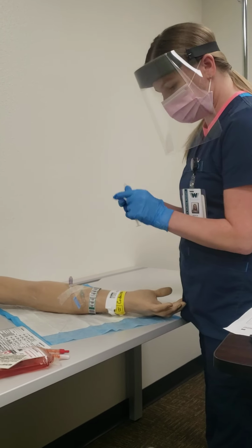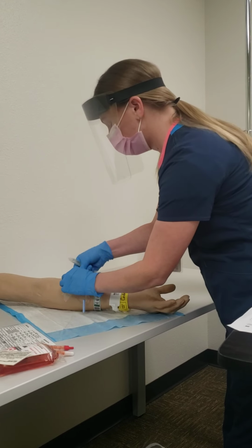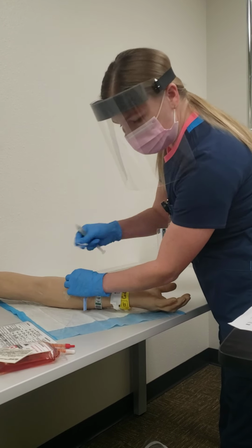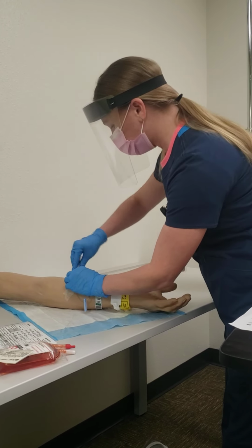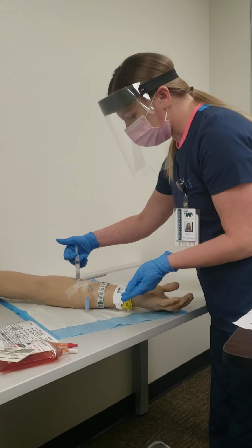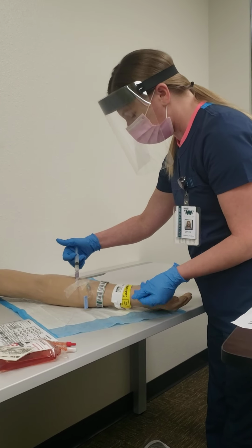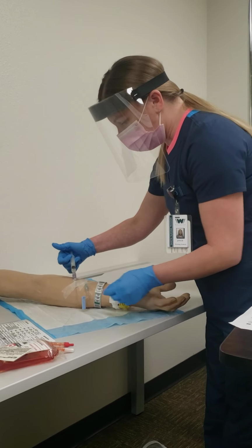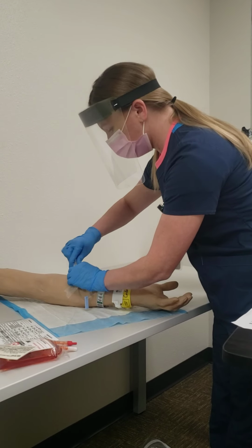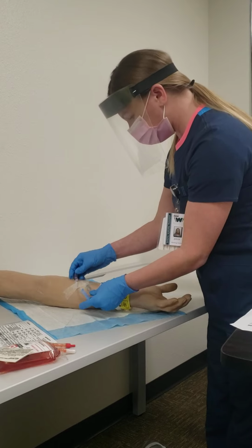Okay, and I'm just going to go ahead and clean this, making sure that the clamp is open. Let that dry. I'm going to go ahead and flush, noting any pain or tenderness that the client is experiencing and just feeling for any infiltration or anything like that. And that looks fine. It's flushing just fine. So I will go ahead and lock that back.